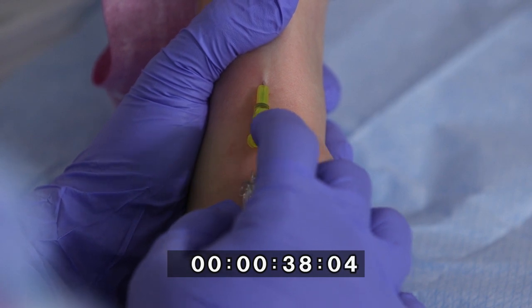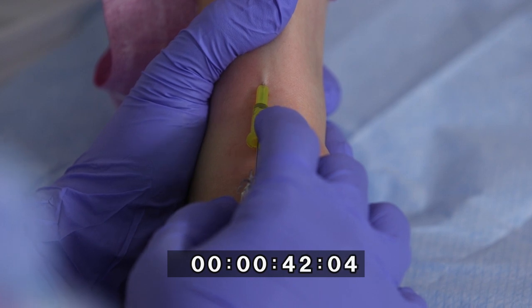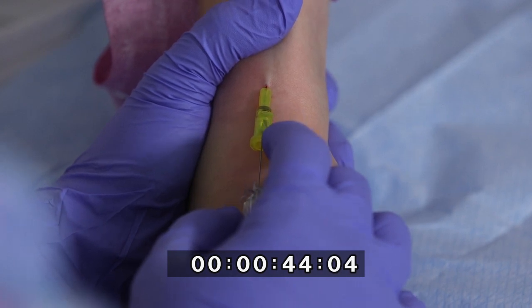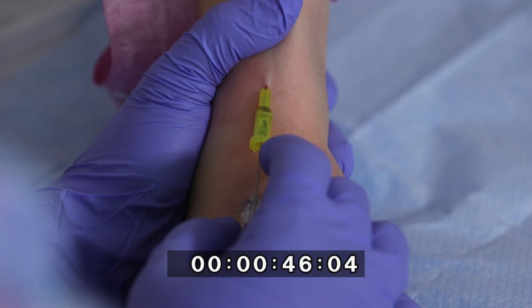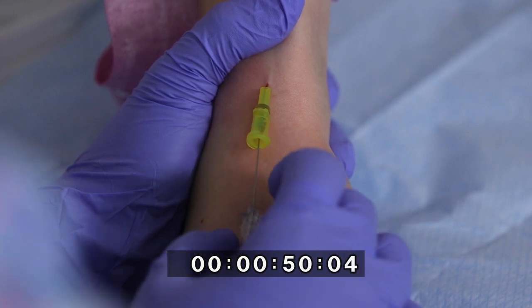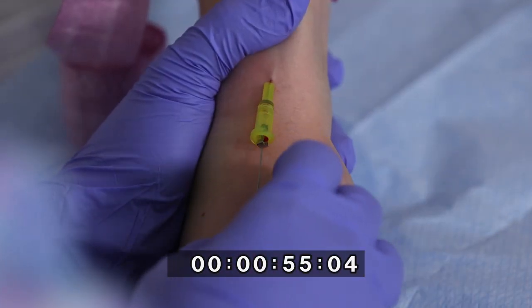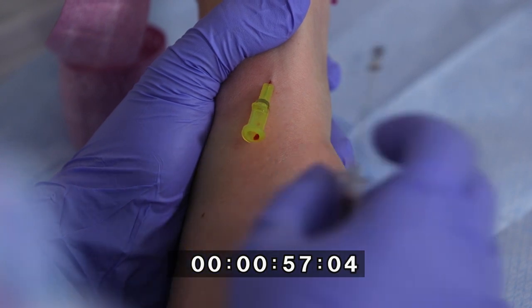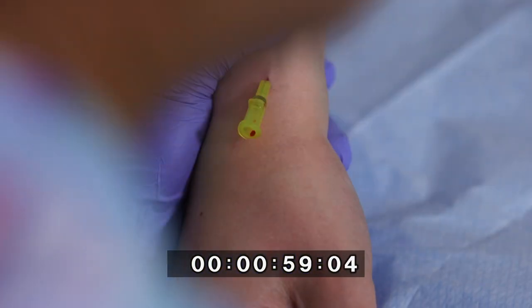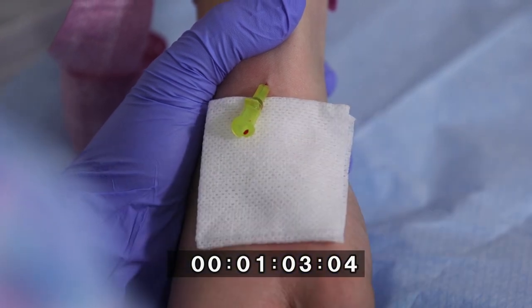She gently pulls the introducer backwards while holding the IV cannula in position. She releases the tourniquet while supporting the device in situ, and removes the stylet gently, activating the needle safety device. She holds the gauze by one corner and places it under the cannula hub to absorb blood spillage if necessary.